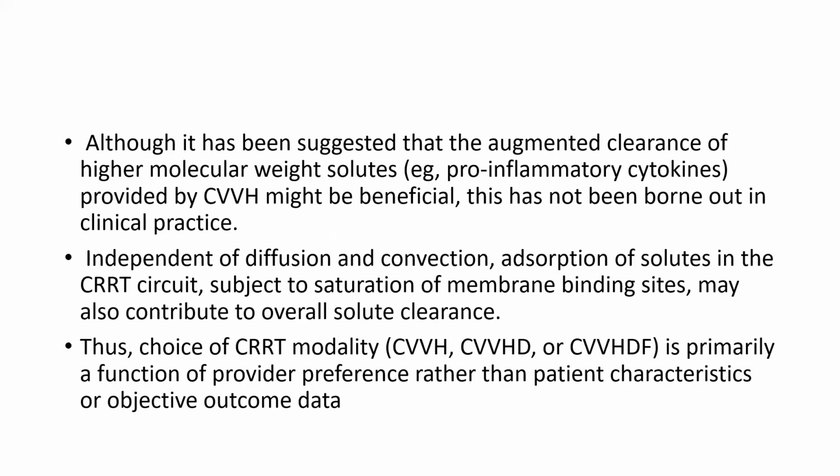Although it has been suggested that augmented clearance of high molecular weight solutes, that is pro-inflammatory cytokines, provided by CVVH might be beneficial, this has not borne out in clinical practice. Independent of diffusion or convection, adsorption of the solute in the CRRT circuit, subject to saturation of the membrane binding site, may also contribute to the overall solute clearance. So the choice of the CRRT modality, whether we should go for CVVH or CVVHD or CVVHDF, is primarily a function of the provider preference rather than the patient characteristic or the objective outcome data.